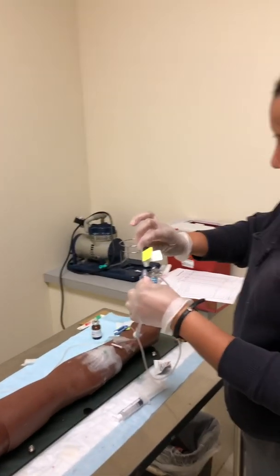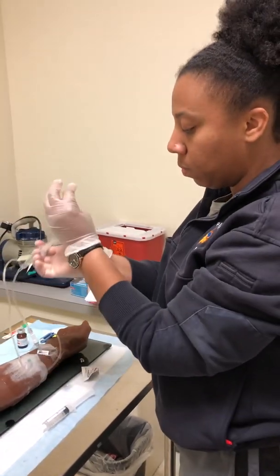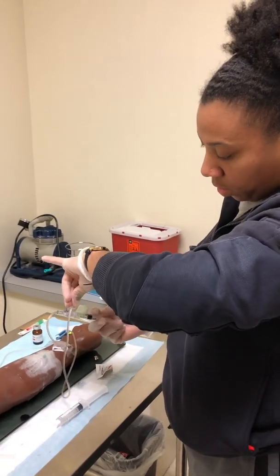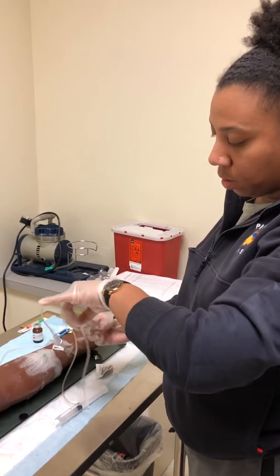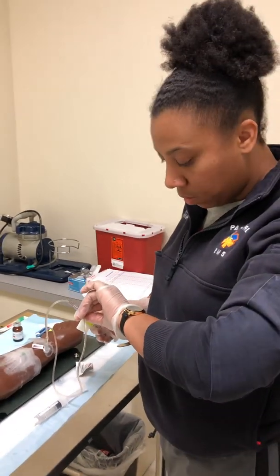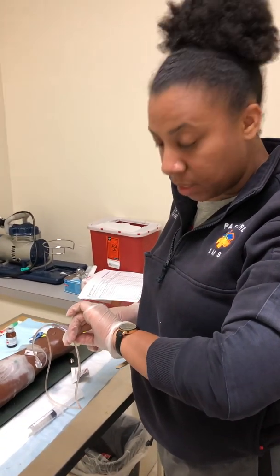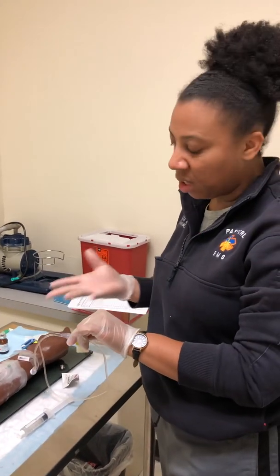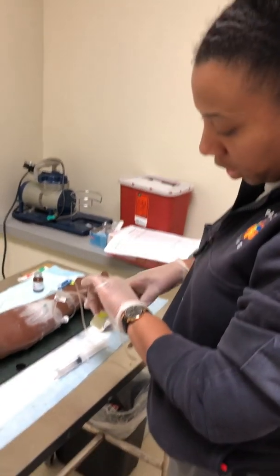Without touching. Insert. I'm going to clamp it and push 2 milliliters. All right, let go and wait a full minute until I give the second part of it, because I can infuse over 1 or 2 minutes. During this time, I would ask if there's any burning sensation, check for any swelling, edema, any leakage while that's going on.